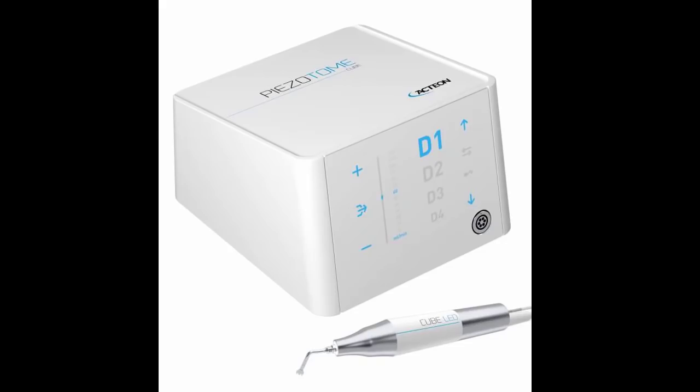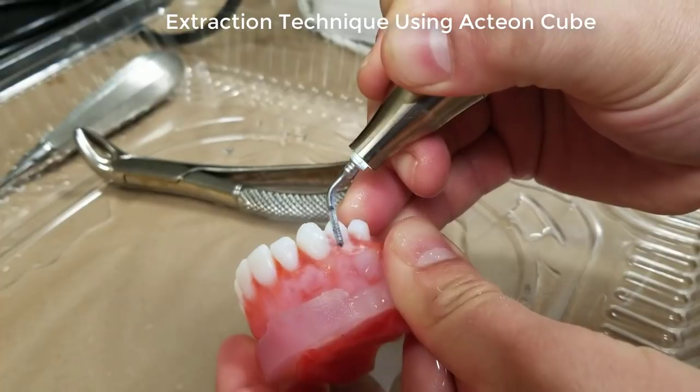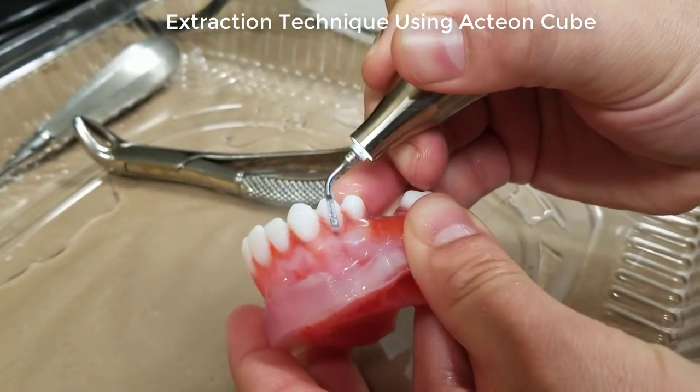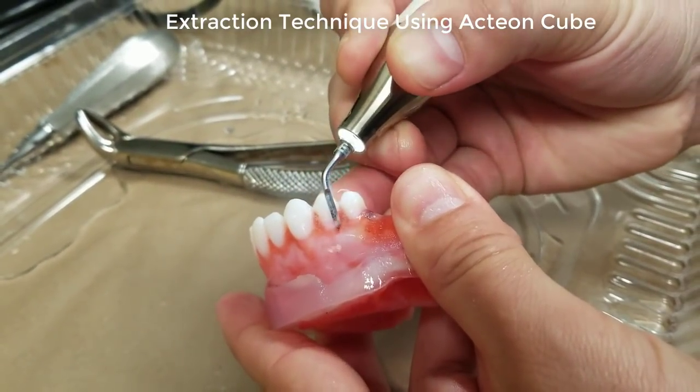This is Dr. Jeff Brooks from the University of Tennessee College of Dentistry in the Department of Oral Maxillofacial Surgery. We'll take the next four minutes and talk about the Piezotome Cube by Acteon and our experience with it in the department here. It's been a game changer for us in terms of extracting teeth and performing immediate implant placement, or extraction of teeth and performing socket preservation at the same time.